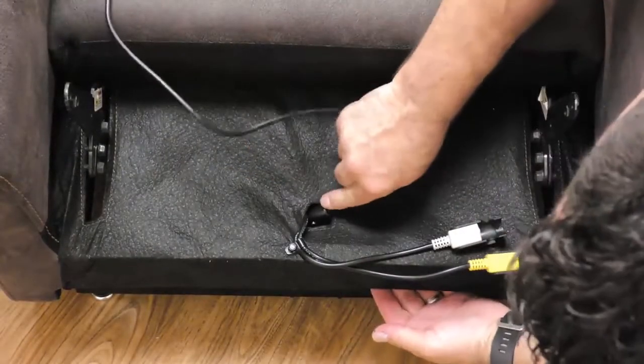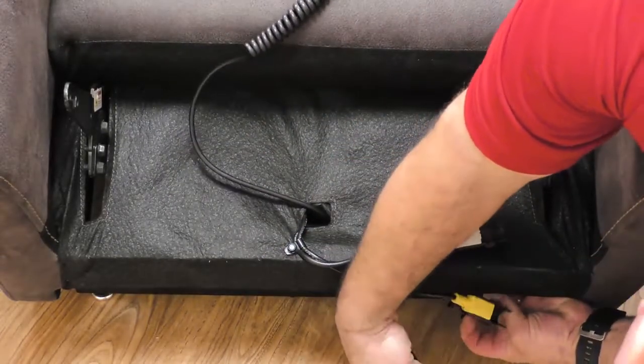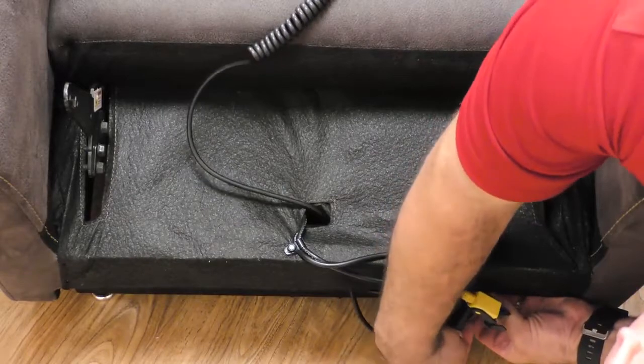Start by routing the hand controller through the middle of the chair, down through the design hole in the base, and connect to the five-pin hand control extension.